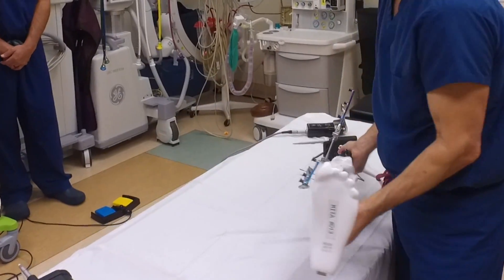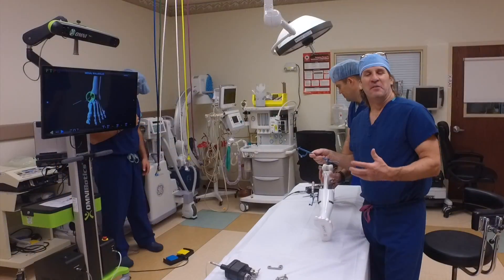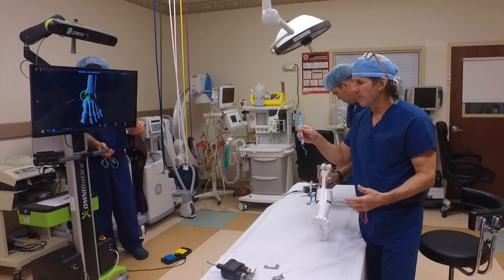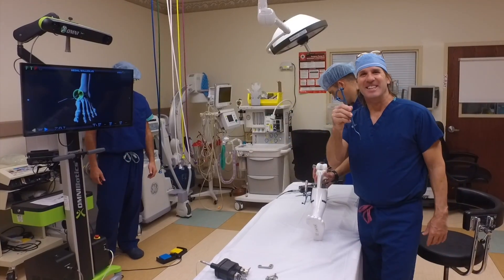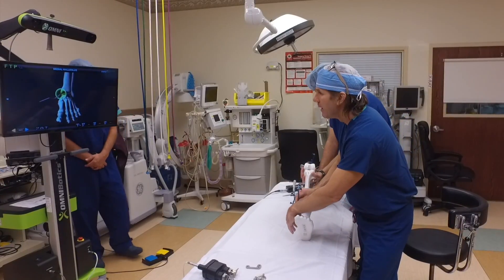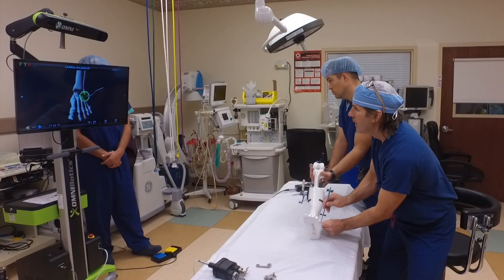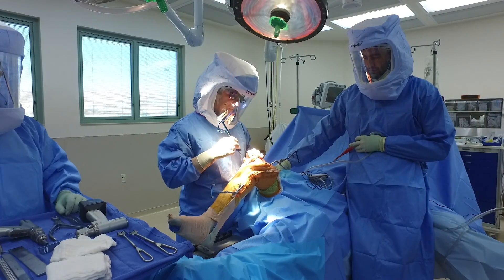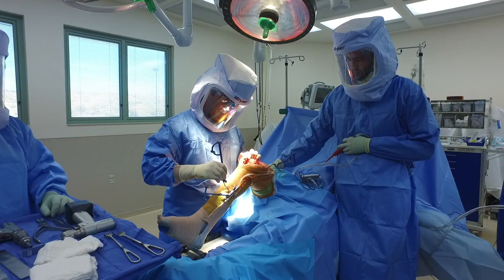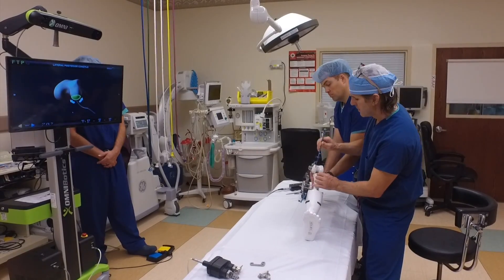Once calibrated, we move straight to moving the leg around so that the computer learns where the center of rotation is for the hip. Then we tell the computer exactly where the landmarks are in space — where is the bone — and we can teach it by using this pointer on various points of access. We come down to the ankle and get both sides, then move up to the knee joint, tracing out the condyles, the epicondyles, and the anterior cortex. All this allows us to get accurate measurements to the computer without the need for a CT or MRI scan. This brings it up on the screen, allowing us to manipulate it and create the knee replacement before we actually do it.